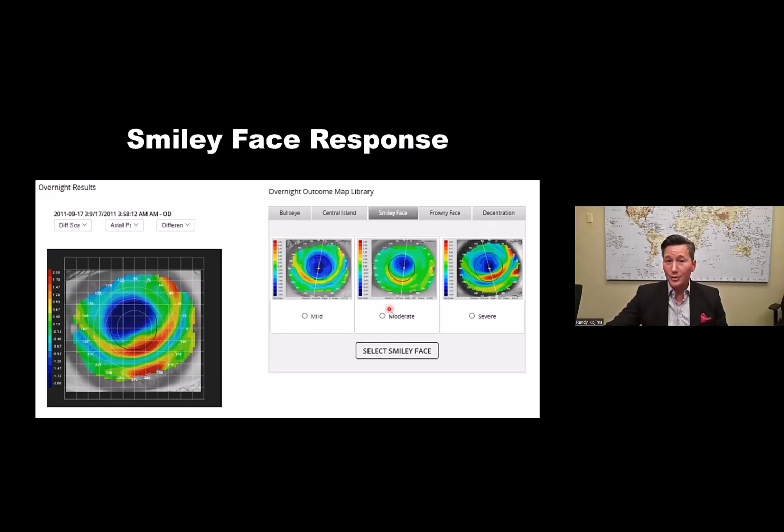If in doubt, always choose moderate. That will create the 1 standard deviation of change. That'll create a significant change to the effect. I would say 95% of the time, I'm choosing moderate for most of the changes.